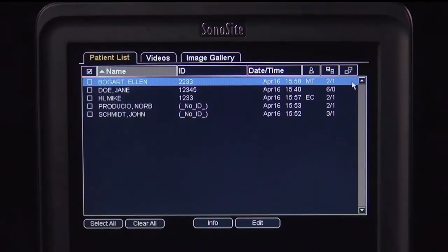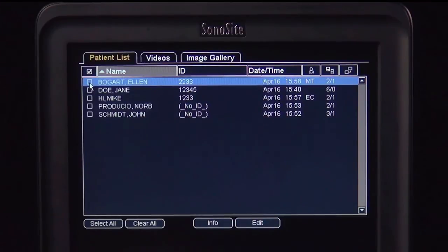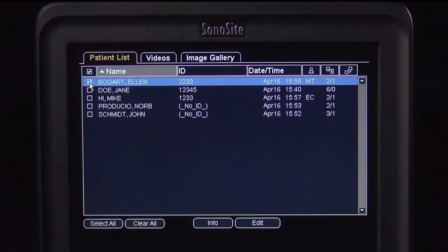To review a patient exam, use the mouse to select a patient exam from the list. The exam highlighted in blue is active. To select a patient exam to archive, check the box on the left. To choose additional patients, just scroll down and select each exam.